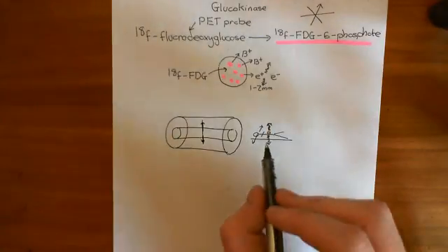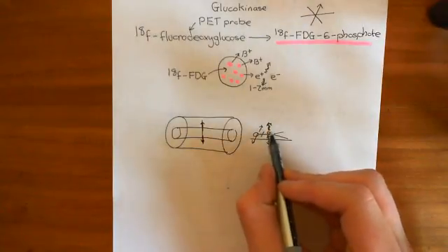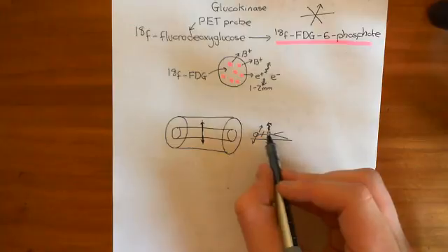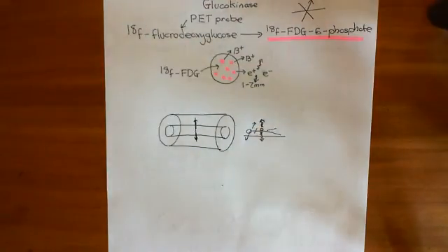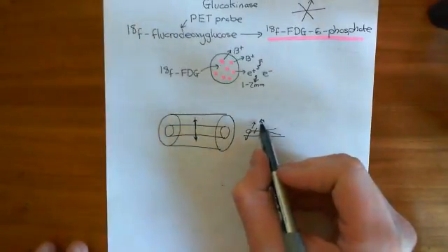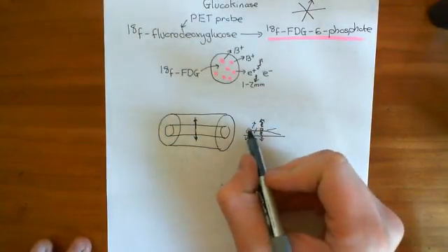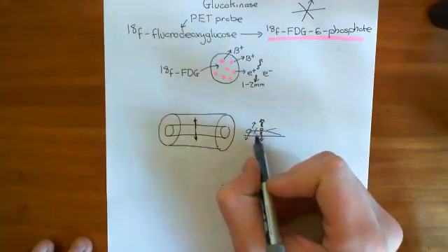And what you'll find is that if this person has a tumor, the positron-emission tomography scan will show that that area is far more metabolically active, i.e. you're getting a huge amount of gamma radiation coming from this area, and not so much maybe from other areas.